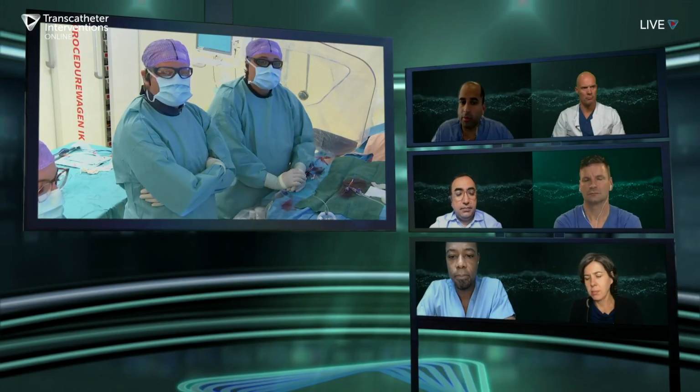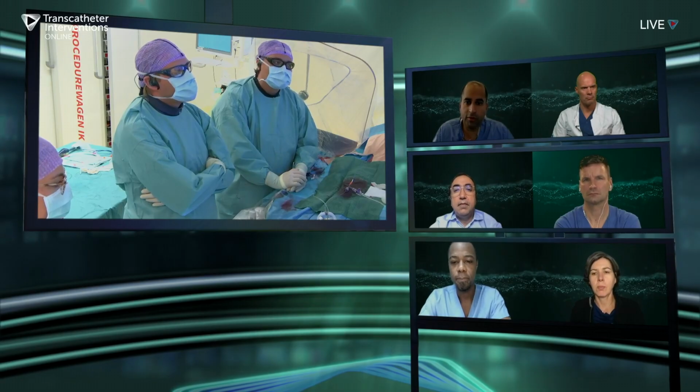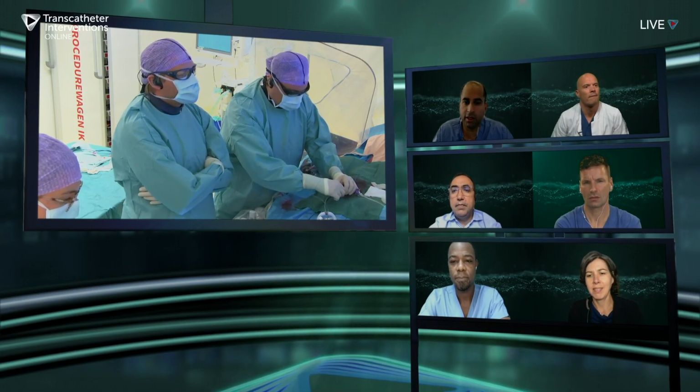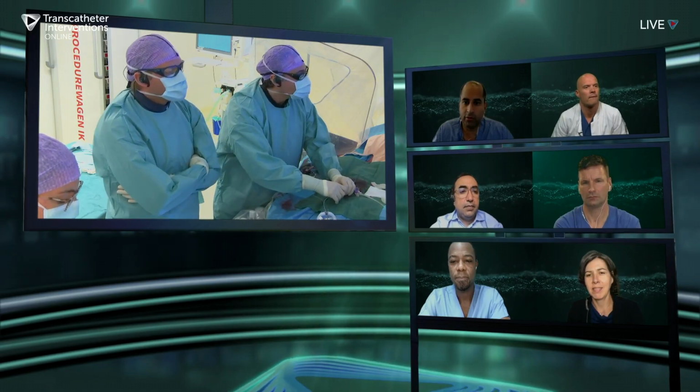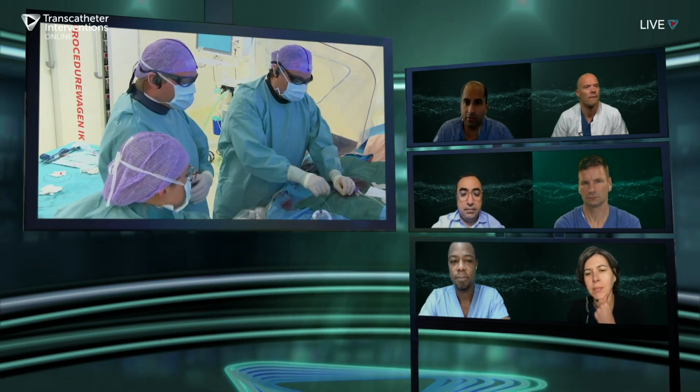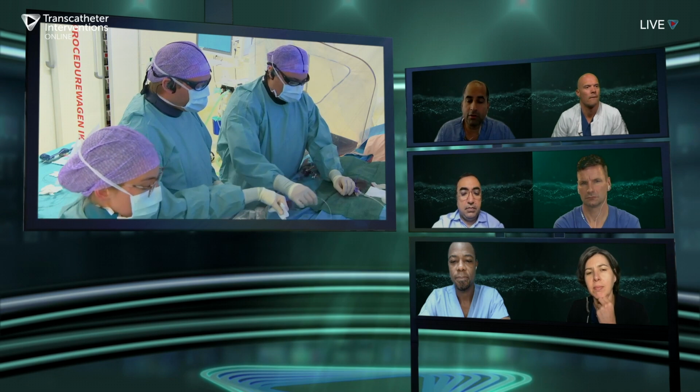That's a very important point, though, because if you're through an RV marginal or something and you end up just stenting indiscriminately, especially the way that IVUS looked, then you're going to shut the door on the main branch. So it may be something where with a dual lumen catheter, you're able to find the main vessel and go that way.